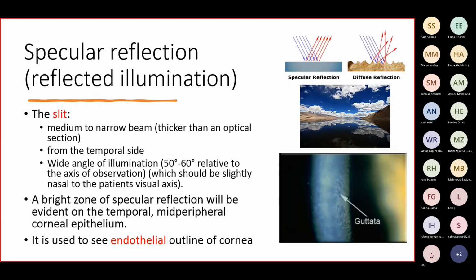Okay. We'll move on. Then we have what we call the specular reflection or the reflected illumination. So this is how the specular reflection appears in nature.